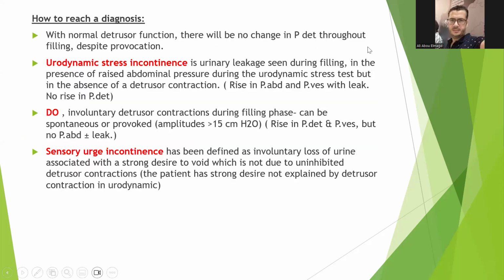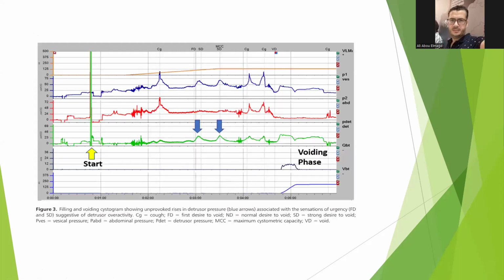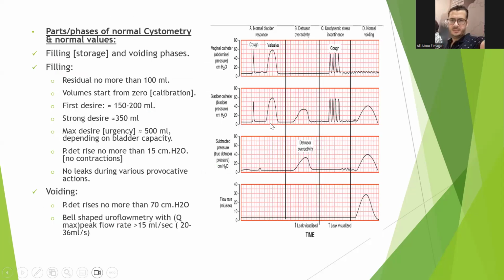How do we reach the diagnosis? With normal detrusor function, there will be no change in the detrusor pressure during the filling phase, despite any provocation. If we imagine the detrusor pressure as we fill the bladder, there will be no rise in the detrusor pressure at all.